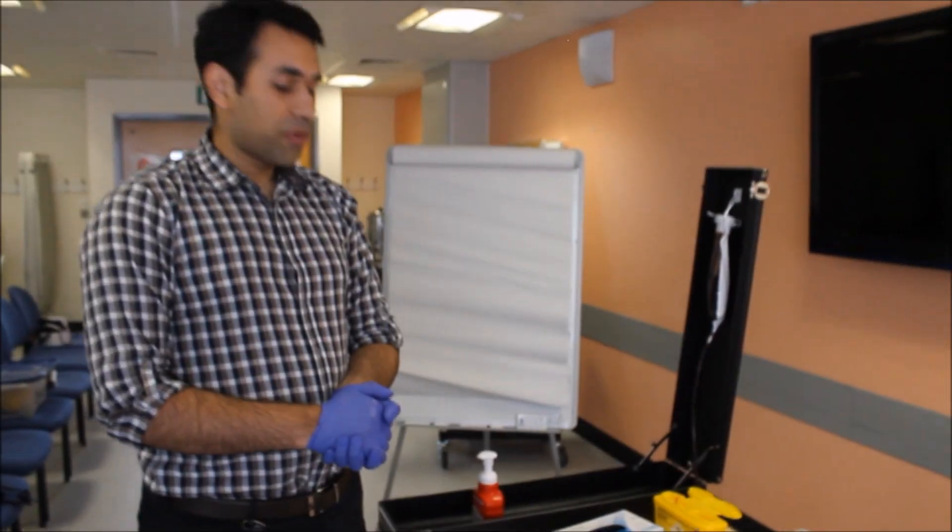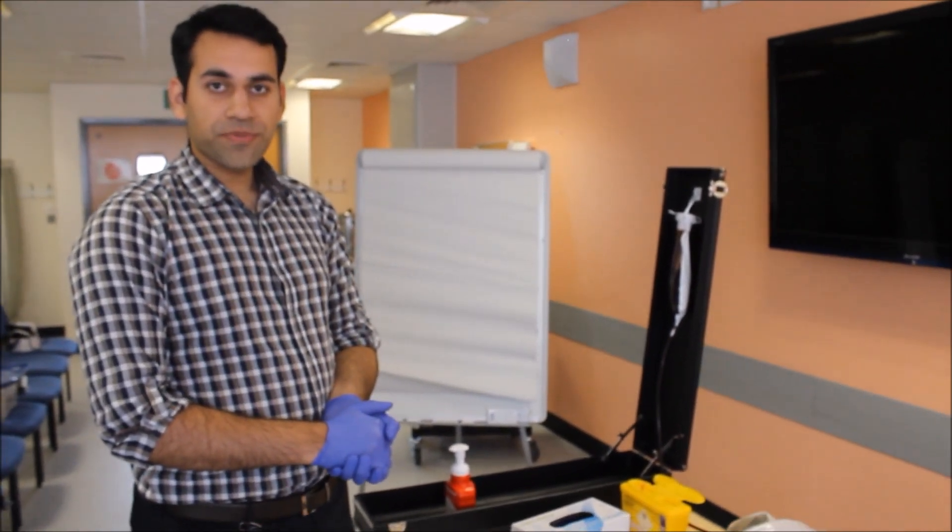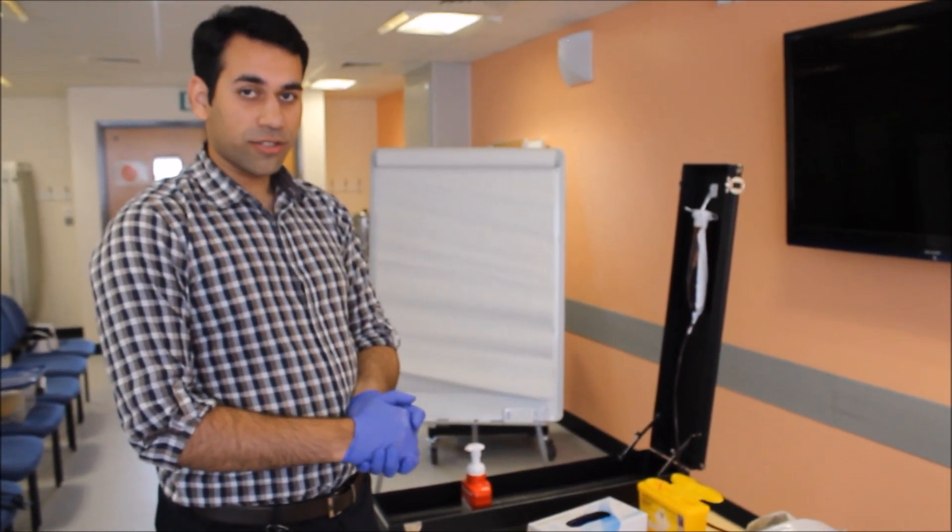Okay, thank you very much. This is the process of cannulation and I hope you learned and enjoyed it. Thank you.